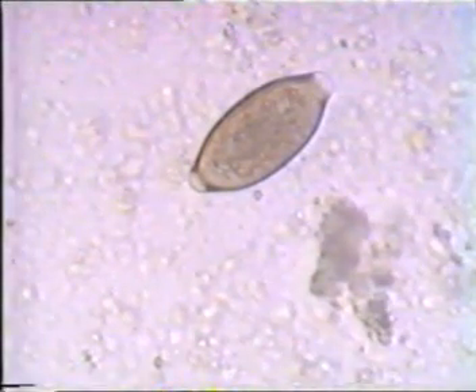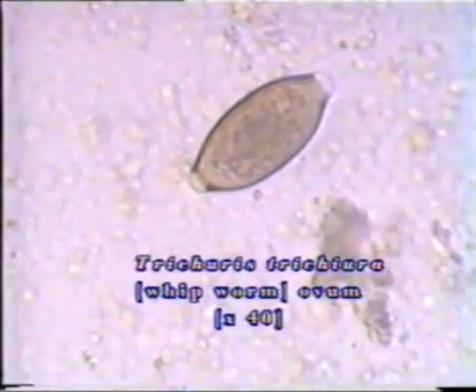Next, let us look at some helminth ova. Trichuris egg has a characteristic rice-grain shape with 2 polar plugs. The brown-coloured egg measures 50 by 22 micrometers. Several types of Ascaris lumbricoides eggs are found in faeces. The common type, oval or round in shape, measures about 70 micrometers. It has an outer mammillated coat and a thick inner coat, with a granular embryo seen in the centre.